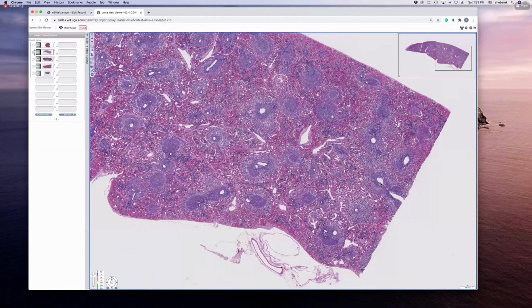So they cover these blood vessels. They sheath these blood vessels. So that's why we call them periarteriolar lymphatic sheaths. It could just be a covering of white blood cells, but it can also have a nodule associated with it.